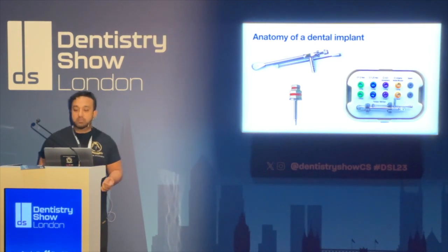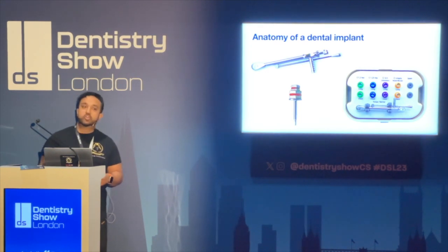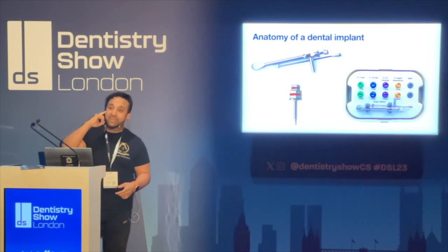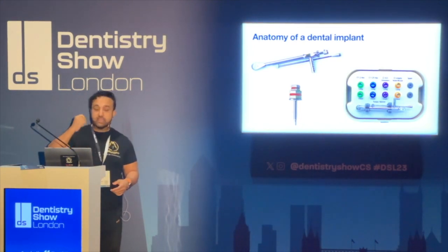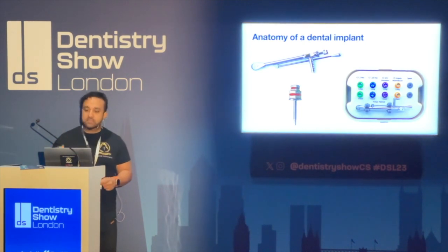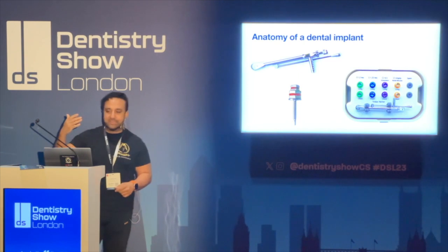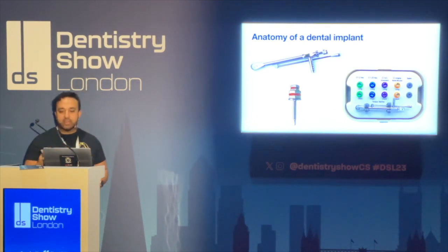The Straumann implants use a slightly different configuration, and you have long and short. The reason you have long and short is if you have an upper 7 with a limited mouth opening, you can't get there with your big fingers unless you're a lovely female with small hands. You need a shorter driver, okay? And that'll get you access there. And you can try them out there.